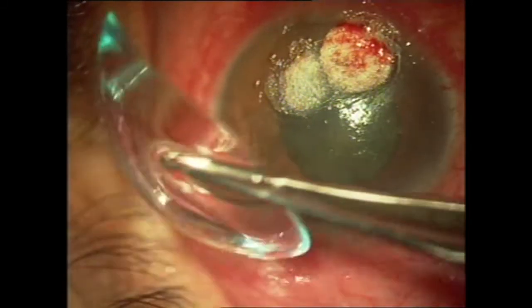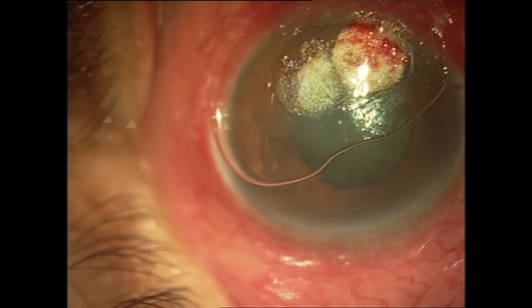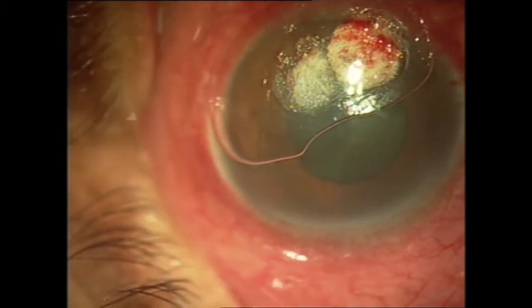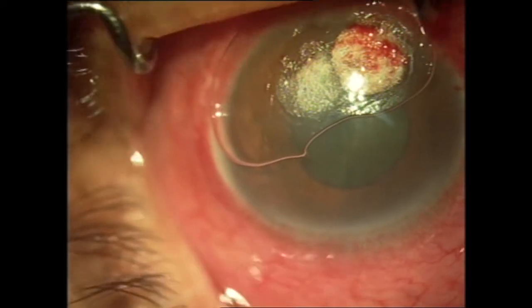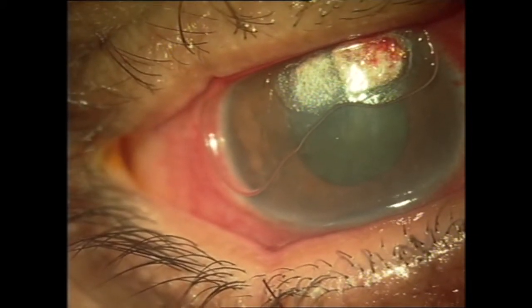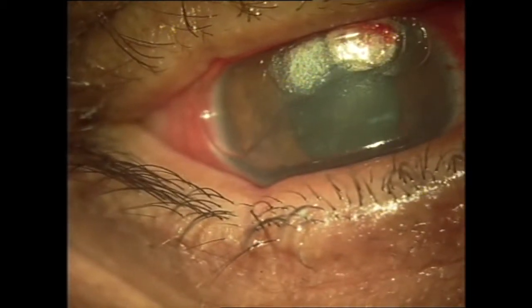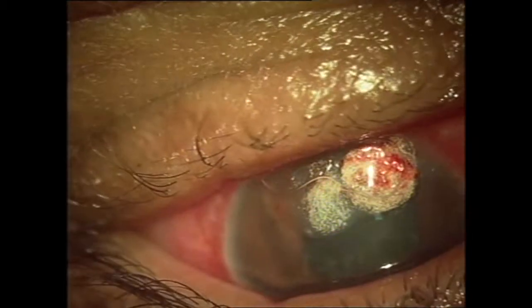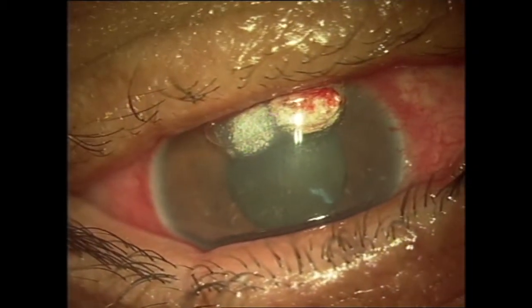Once the glue solidifies, a bandage contact lens is placed over the glue to avoid conjunctival irritation from the rough surface. Topical medications are then continued. Once the healing is complete, the glue dislodges itself as the epithelialization progresses under the glue, or it may have to be removed, usually 2 to 3 months after the application.